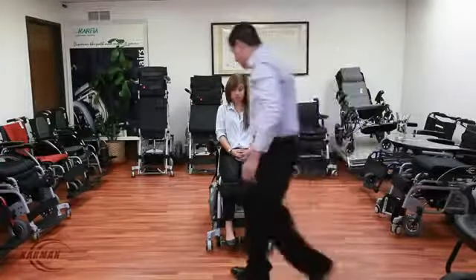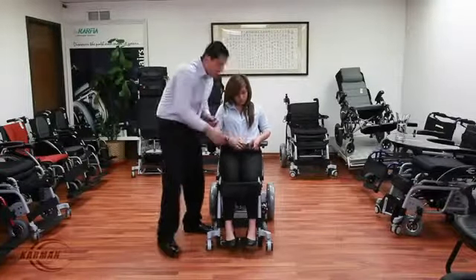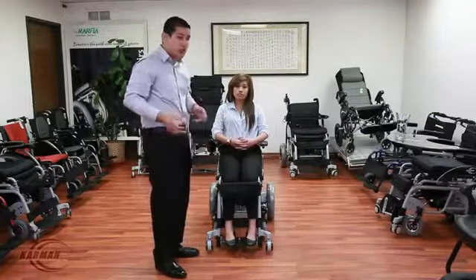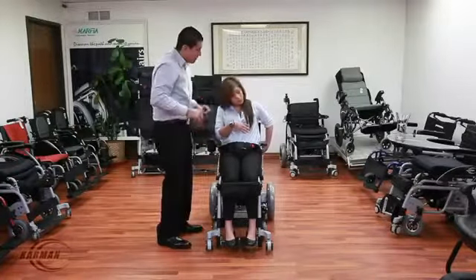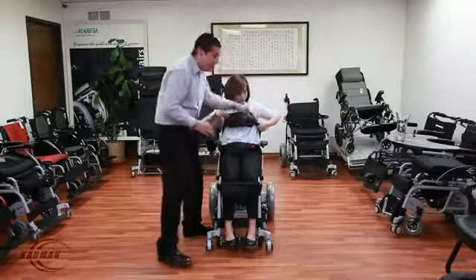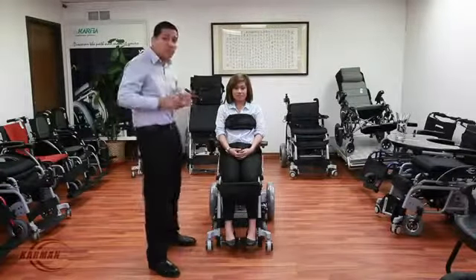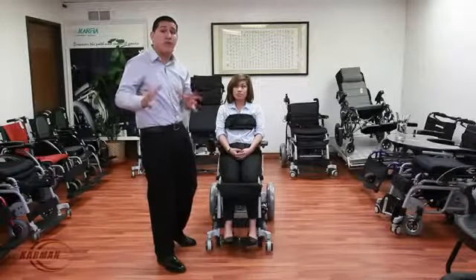Let's show you guys the rest of the safety features. Second feature right here: lap seatbelt. Just like how you would find in a car, this lap seatbelt is an added safety factor that ensures more security and safety. The last safety feature is the chest strap. This chest strap ensures the patient is well secured and ensures they do not ever have to worry about slipping or falling out of the chair.